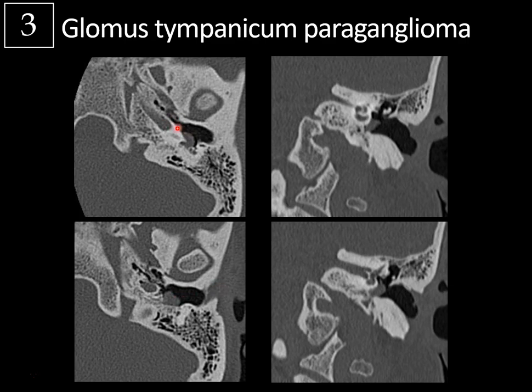So you want to make sure there's an intact tympanic plate and no continuous soft tissue extending from the carotid canal to the overlying cochlear promontory. Another tumor to think about is a glomus jugulotympanicum, a different paraganglioma that also involves the jugular canal, which would have associated osseous destruction of the floor of the middle ear — which we don't have here. The floor of the middle ear looks intact. And for bonus points — what cranial nerve passes right here? That would be the hypoglossal nerve, passing through the hypoglossal canal.